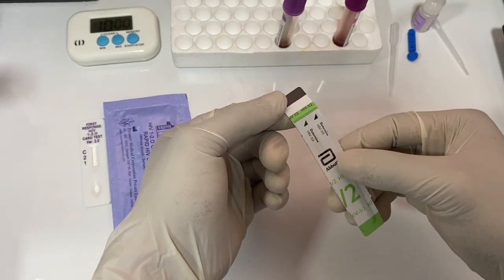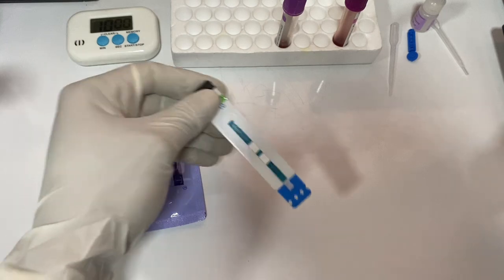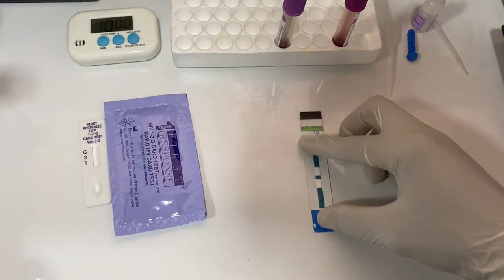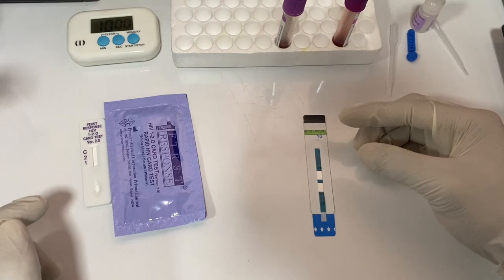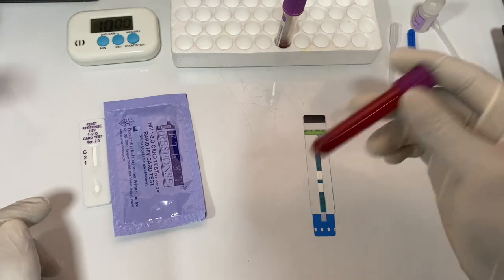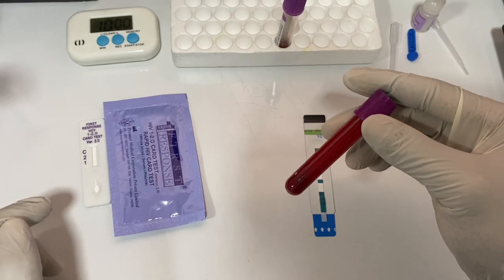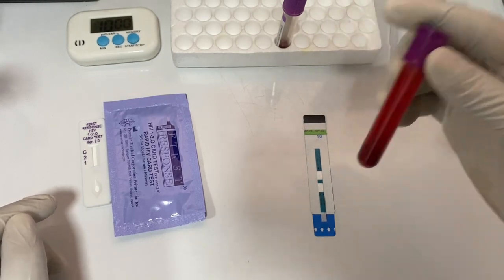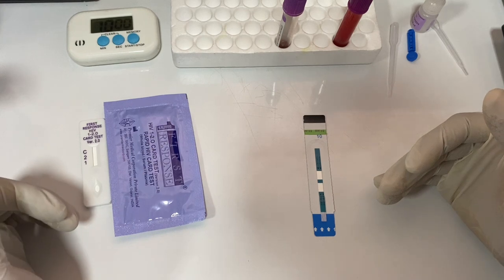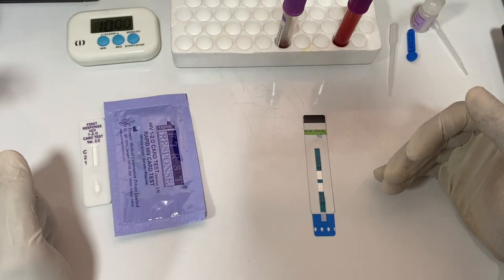You take the test strip and peel it open. After peeling it open, you are going to take your blood sample. I have the blood sample here — this is whole blood. What you do is spin it to obtain the serum, because this test is an antigen-antibody test. I'll explain more of that in detail.